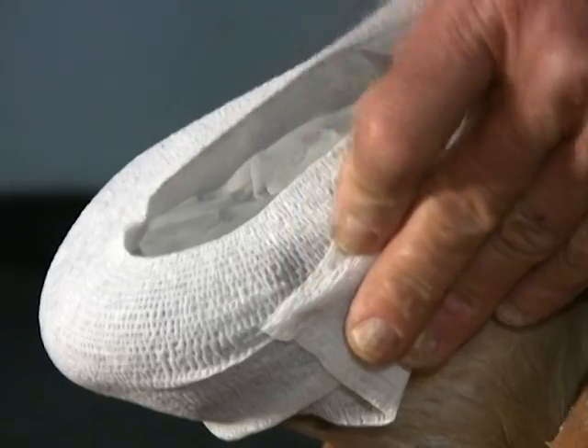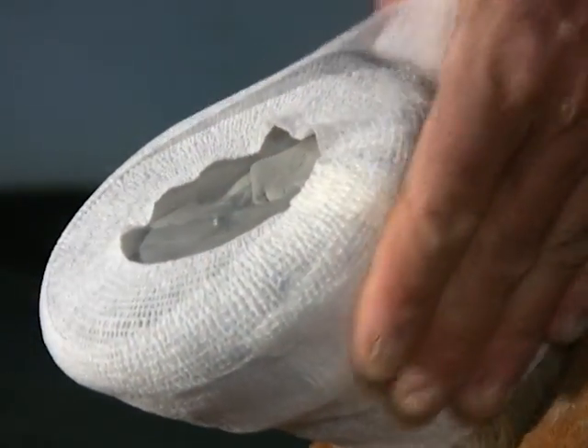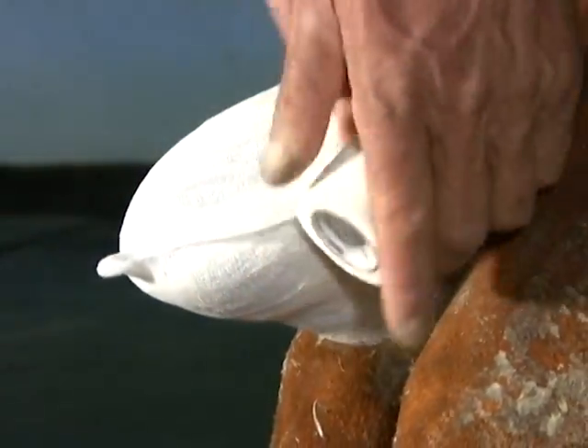Once you're satisfied that the rubber has made contact with the entire hoof surface, cover it with vet wrap, pulling it snug to push out any air pockets, but avoid pulling too tight at the edge of the foot to prevent the sharp edges of the hoof from cutting through the mold.